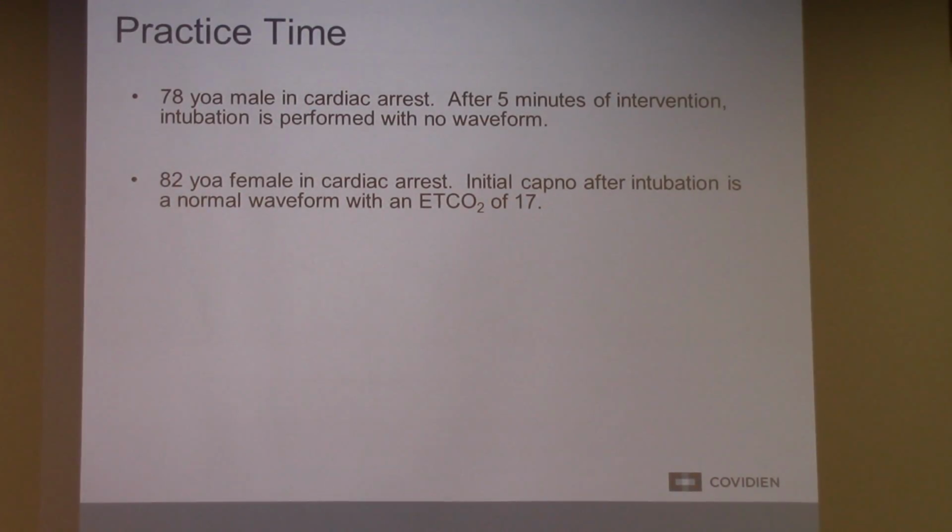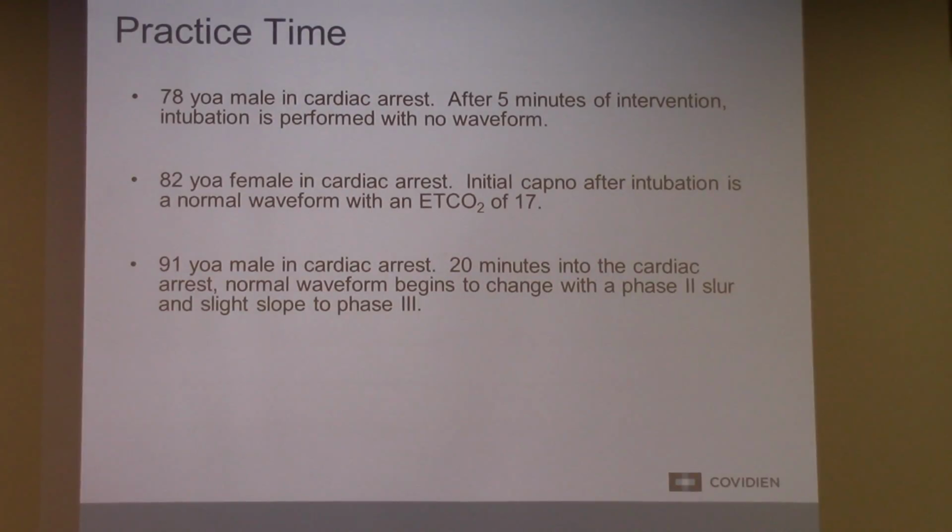Better CPR. Quality of CPR. Don't hyperventilate. Don't hyperventilate. If those two don't work, consider bicarb.